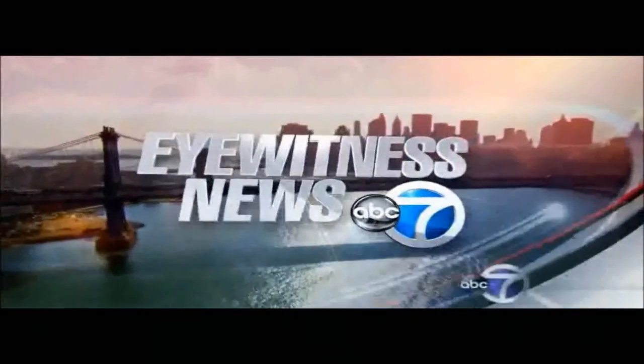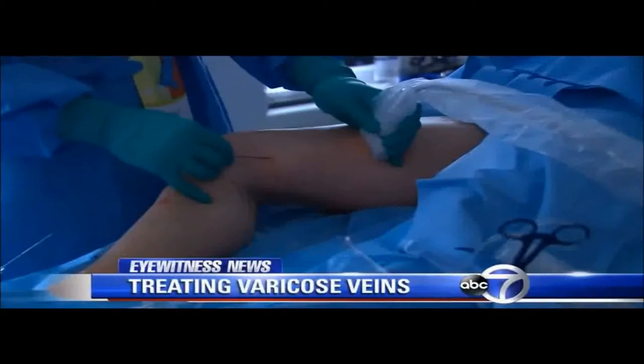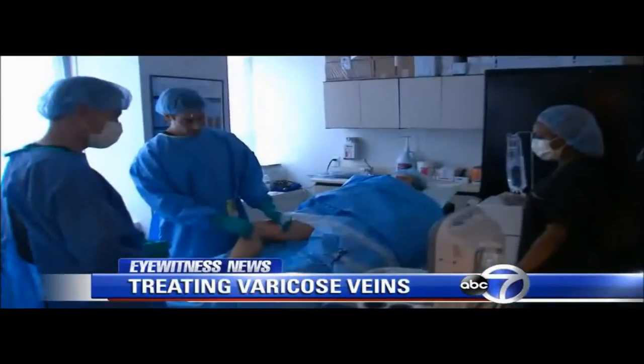You're watching New York's number one news, Channel 7 Eyewitness News. Zapping away those varicose veins — with less pain and no scars, we're gonna show you how it works.